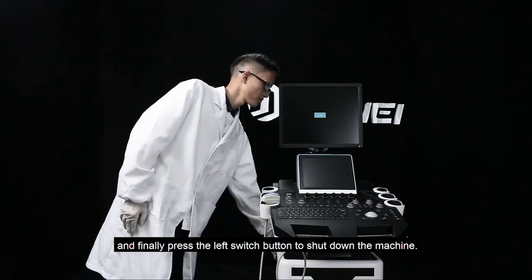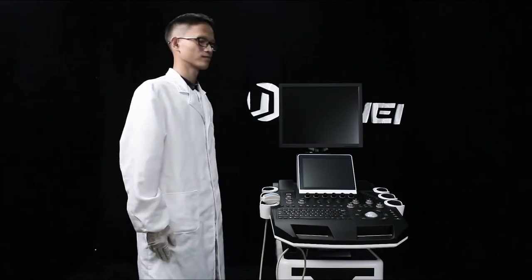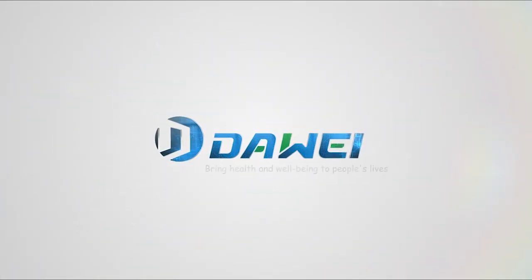And finally, press the left switch button to shut down the machine.